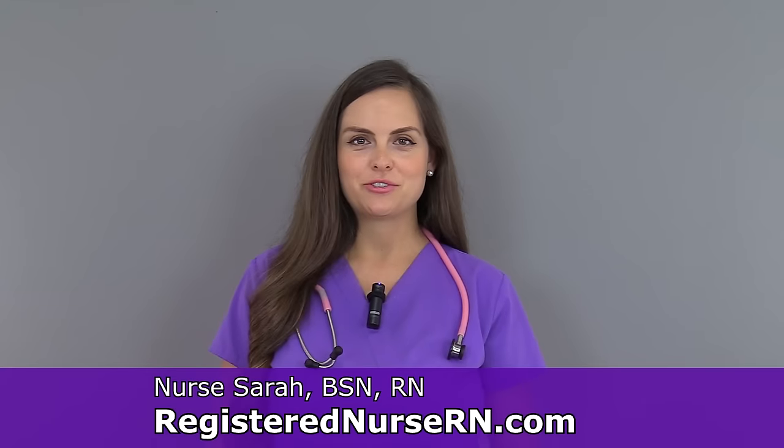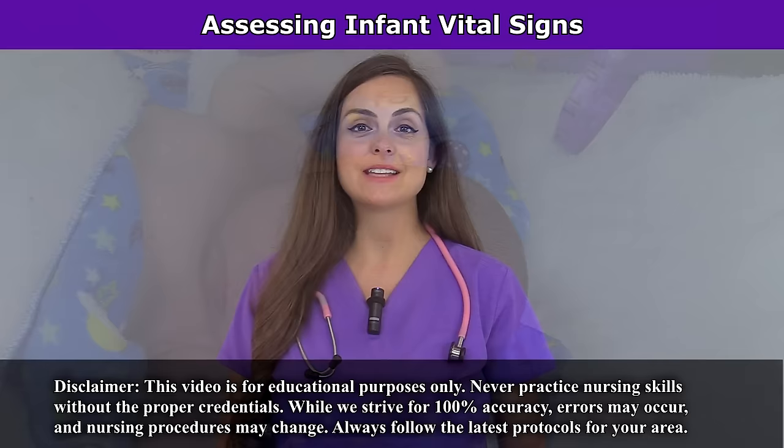Hey everyone, it's Sarah with RegisterNurseRN.com and in this video I'm going to demonstrate how to assess vital signs on an infant. So let's get started.